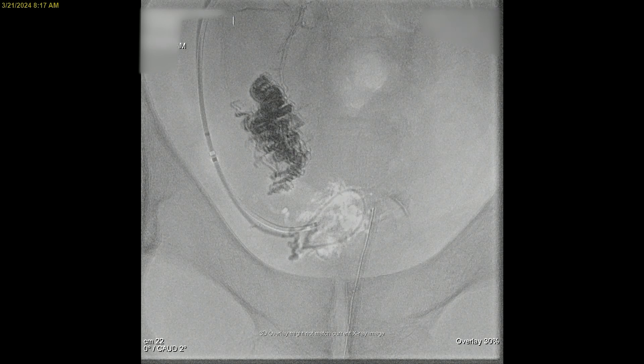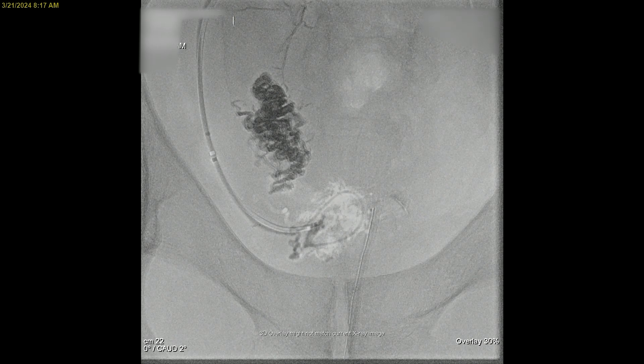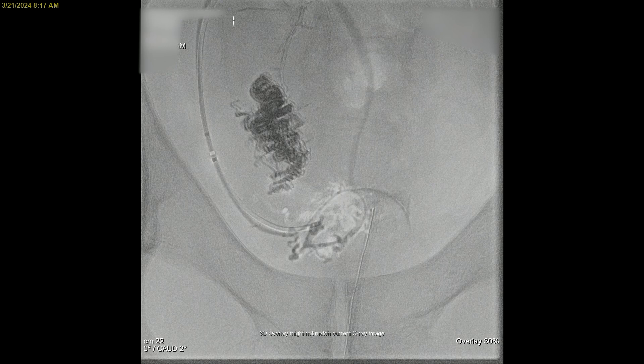The onyx appears as a black area. When doing this actively, we have two screens — one with the overlay and one without — so we can see how the onyx is filling up those malformation-type vessels. There's really nice embolization way down into the nidus of the malformation.